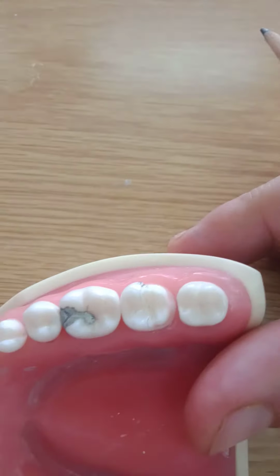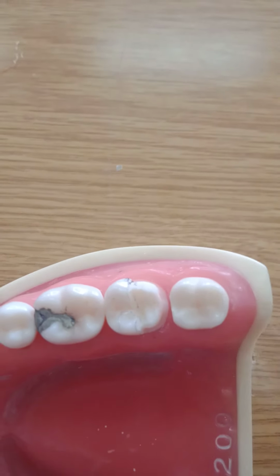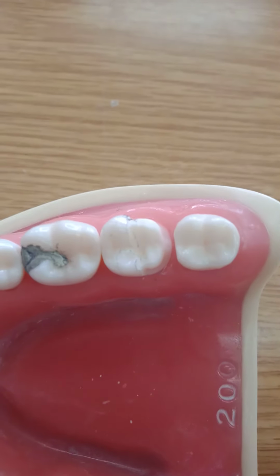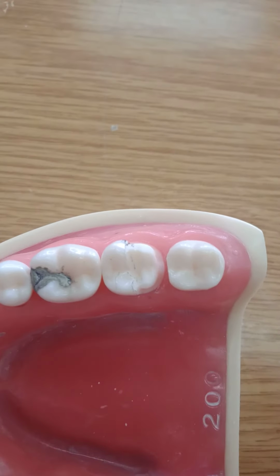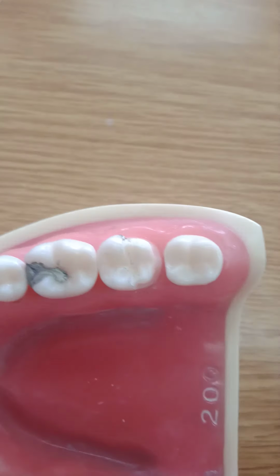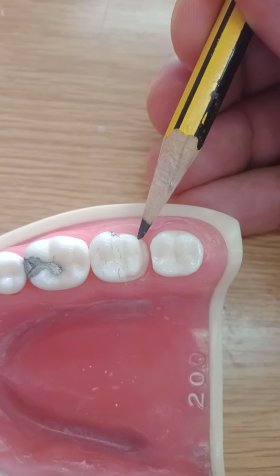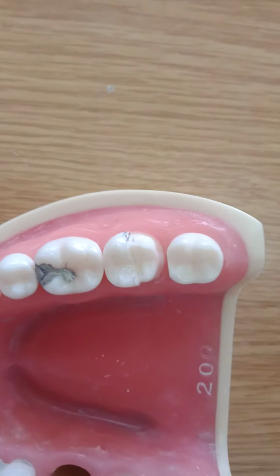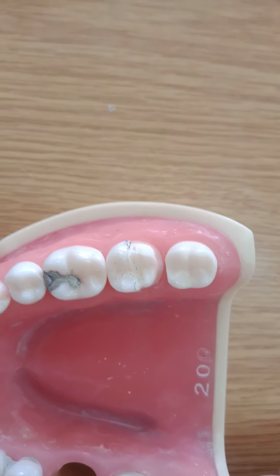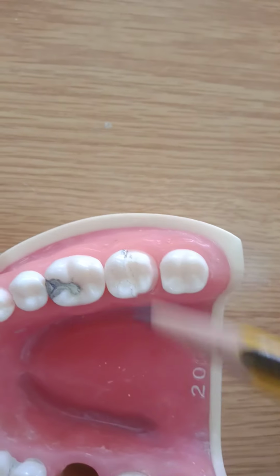Distally, yes, I could see the path of insertion. Looking at the camera, I'm trying to find a path of insertion, tilting back and forth. I could find a good path of insertion here, but I've lost it here. That means you have an undercut here. If I'm using this as a path of insertion, I've lost the lingual one now, so you have undercuts.